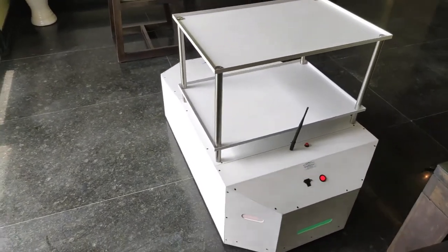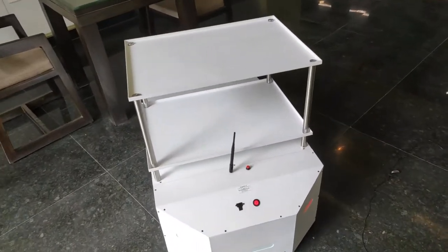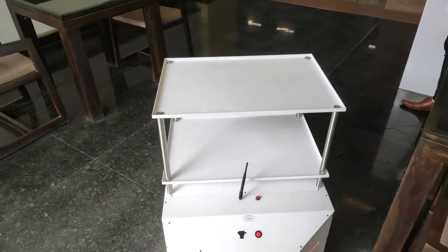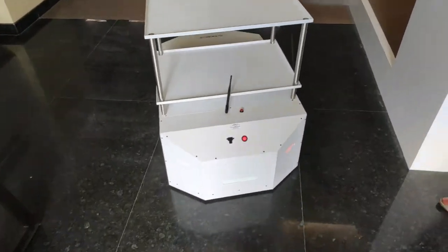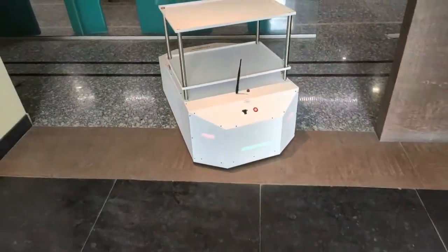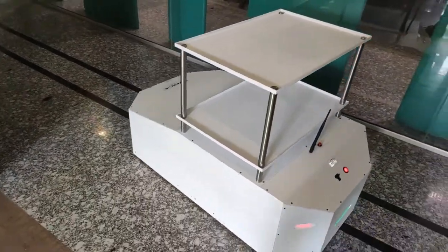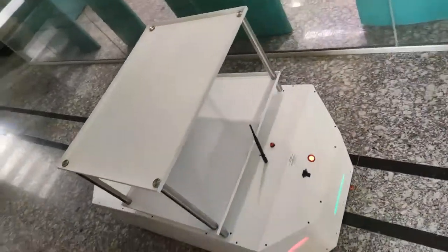You can see the cart can be easily moved in complex locations because of its small and compact design. The working of this cart is very smooth and it can be easily run in the corridors and lobbies of any hospital and COVID-19 isolation centers.